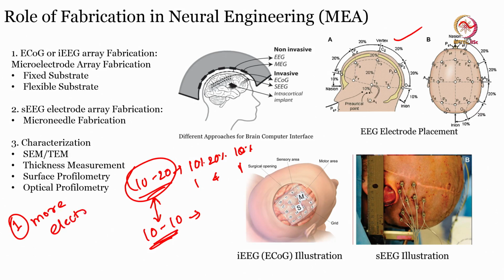It is a very basic and easy question. Here you see the electrodes and everything being shown. One other important point: I told you midline is denoted by Z, but when I consider all the electrodes on this side, this is the top view, all the electrodes on the left side have odd numbers.